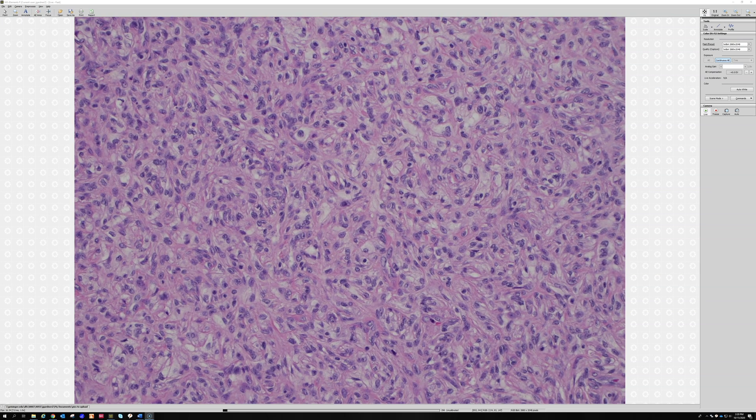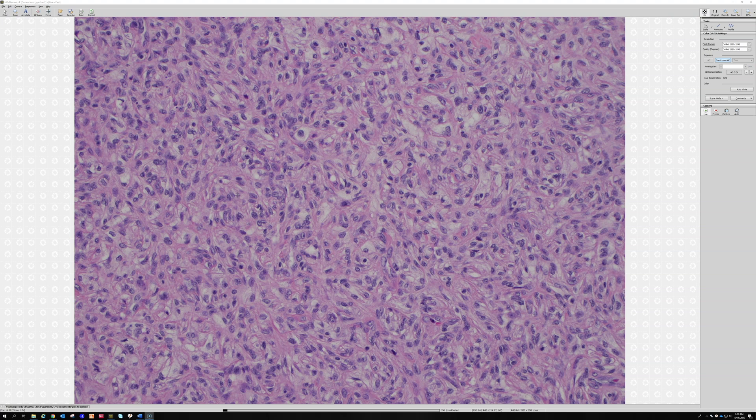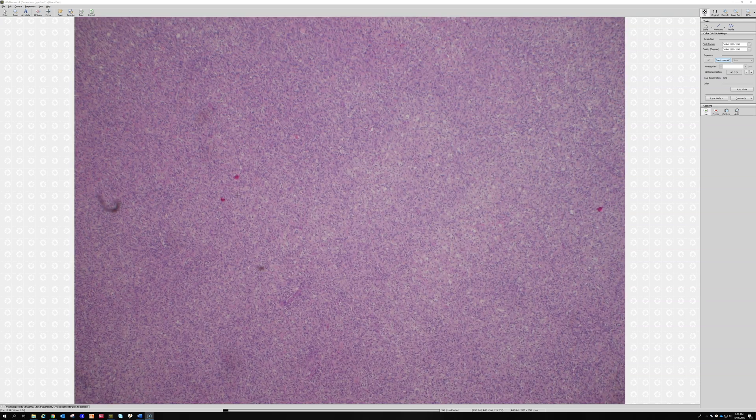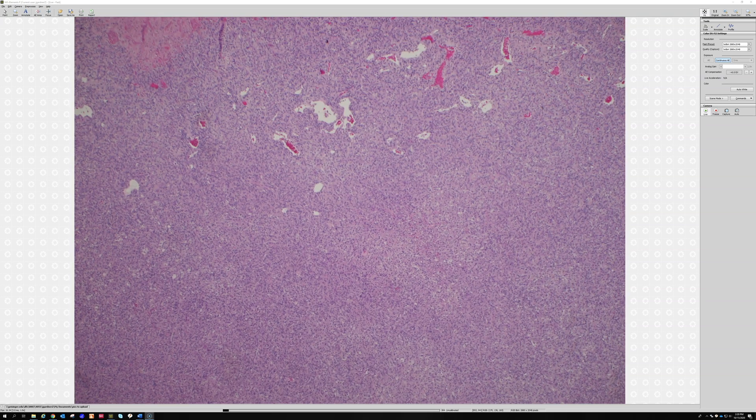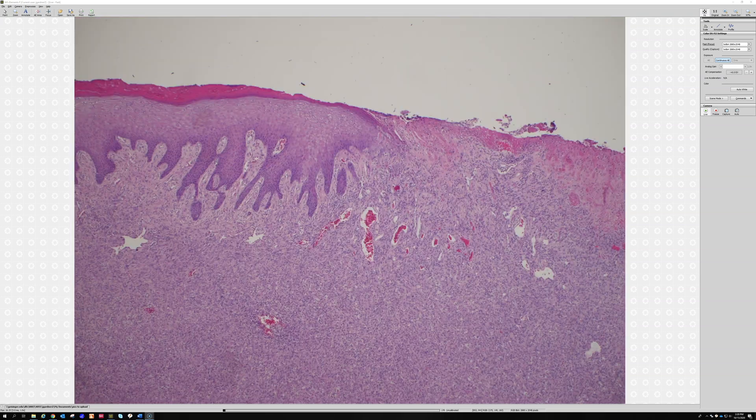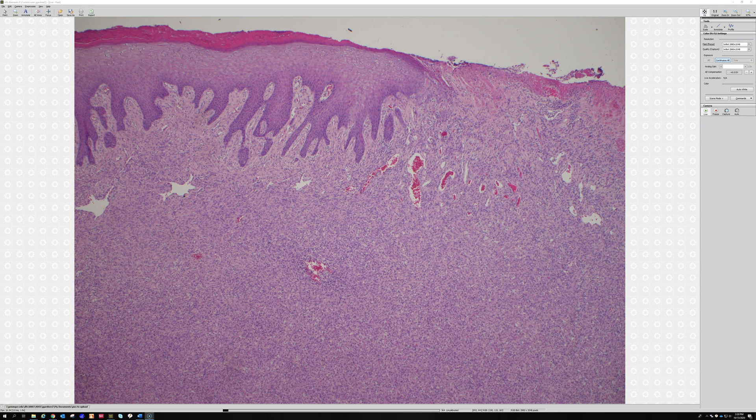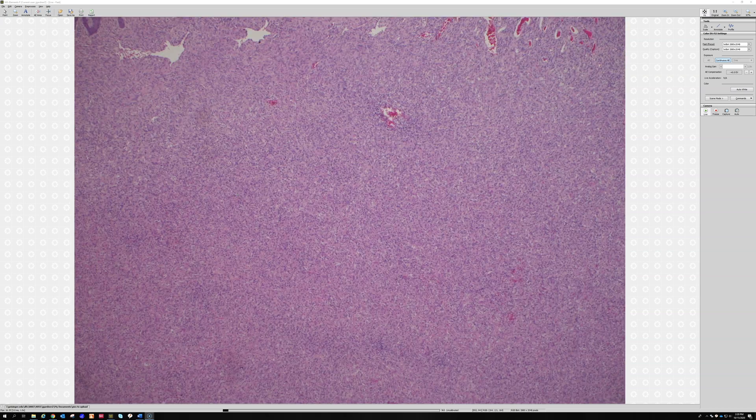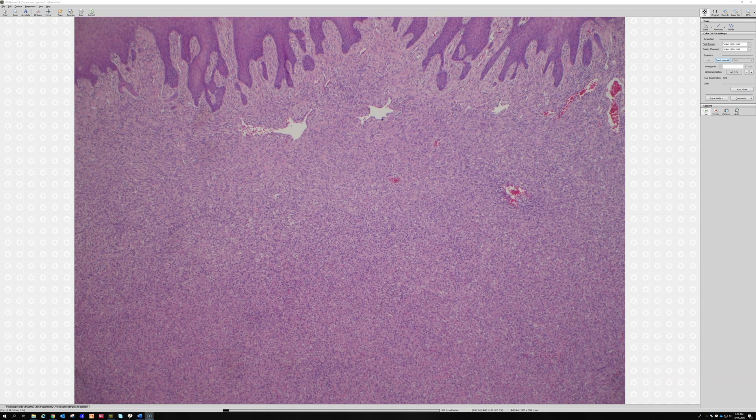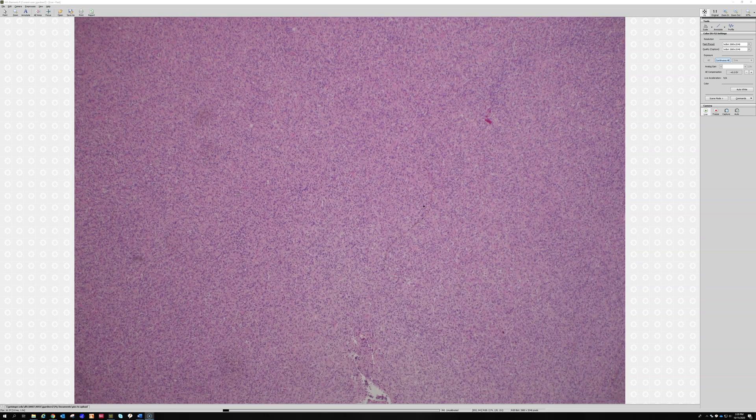When you see real prominent lipidized foamy cells, sometimes it's so much that it can look like a xanthoma. That would be another thing to think of here, except xanthomas are going to be all foam cells and really not like these sheets of non-foamy stuff. They're going to really be less cellular than this usually. You can occasionally have really large xanthomas like tuberous and tendinous xanthomas, but they're going to be a lot less cellular than this.